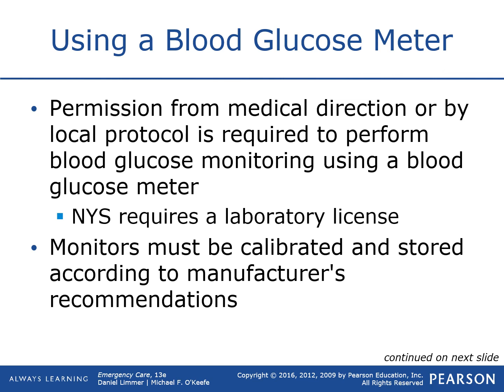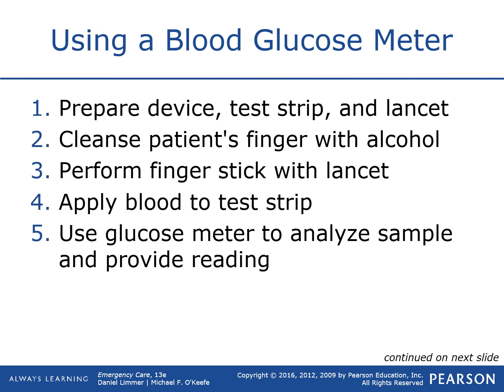Your monitors must be calibrated regularly. Where I work full time, we calibrate ours once a week. We have test solutions that we put a strip in, and we use the test solution instead of blood, and it's supposed to give a reading in a specific range. That's our calibration to know that we are still reading the correct range. And we actually have a low solution and a high solution that we use for that. So these are the steps to do a blood glucose stick. I discussed a little bit when we were looking at the picture. And again, if you need help with this, feel free to see me in person to do this.